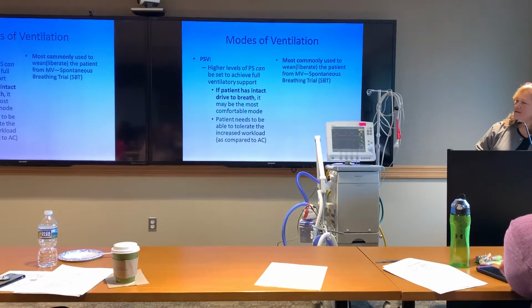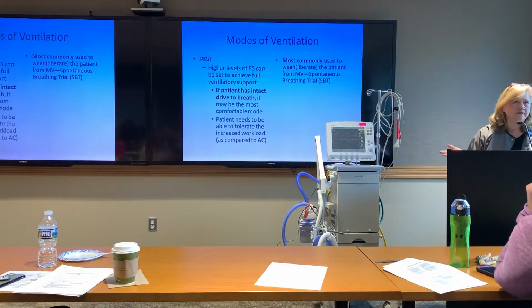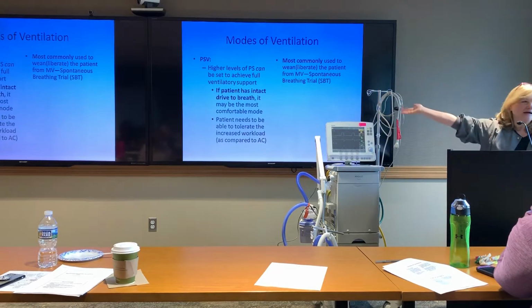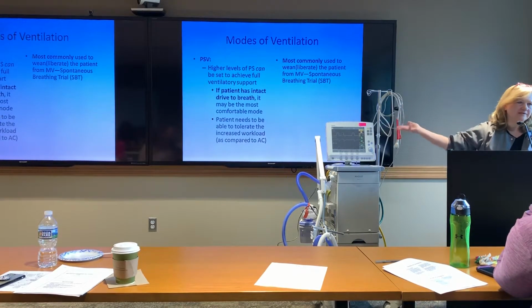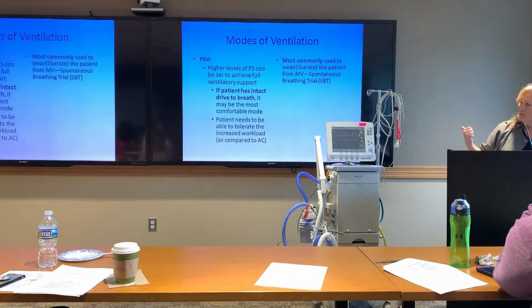All right. So I've been doing some reading on UpToDate, and actually you can't do full ventilatory support in pressure support mode because they count full ventilatory support as the patient doing nothing. I think, no, well, you can set a high pressure support level and have tidal volumes equivalent to 8 mLs per kilo. I don't see how that isn't full ventilatory support, but the patient does have to do a bit of work with pressure support. So if they're prone to desatting, it may not be something they can tolerate. You guys have probably seen that. They're on pressure support until they have fatigued themselves, and then we have to switch them back to an assist control mode.